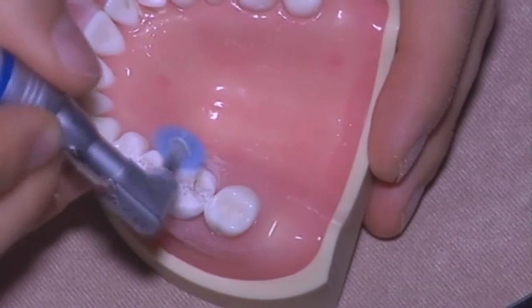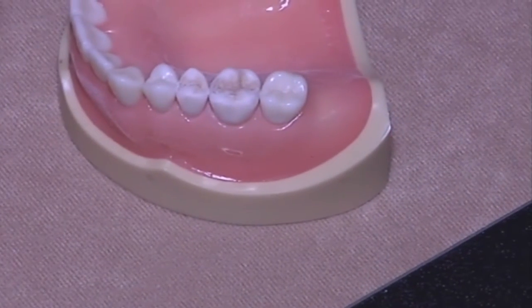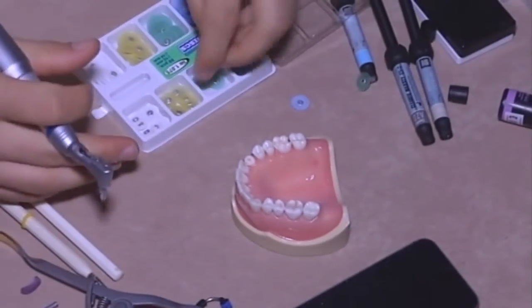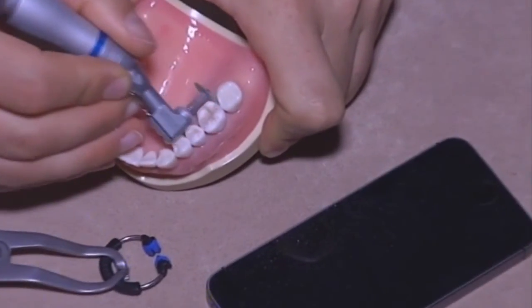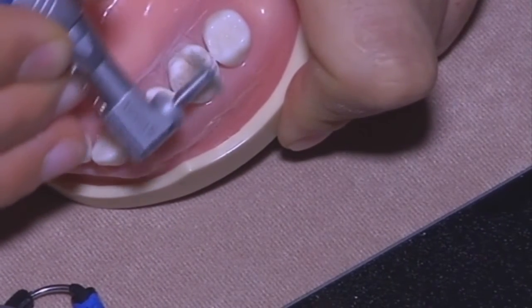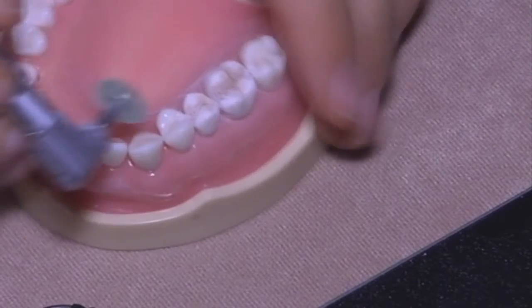Then blow, and you can just step down in grain size of your disc in order to have also a polishing effect.